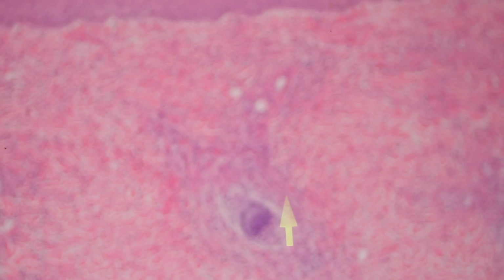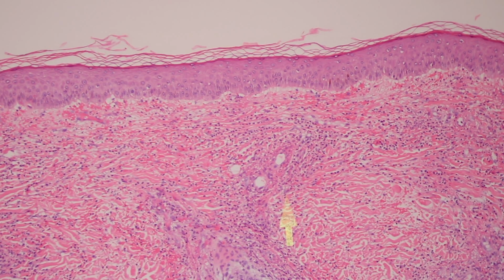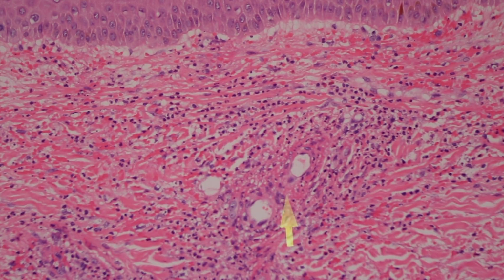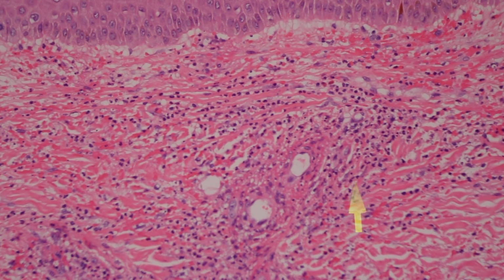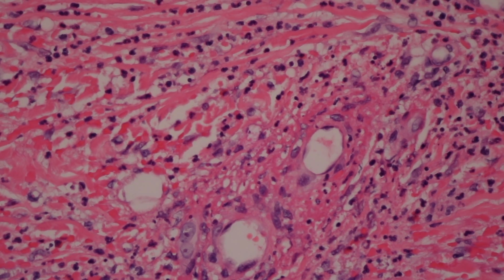And when we look closer, again, there are damaged vessels, just like before. There are vessels here, and there's nice fibrin around them, neutrophils, and there's nuclear debris, little dust out there surrounding the vessels. So a really good example of the pattern of small vessel neutrophil-mediated vasculitis here.